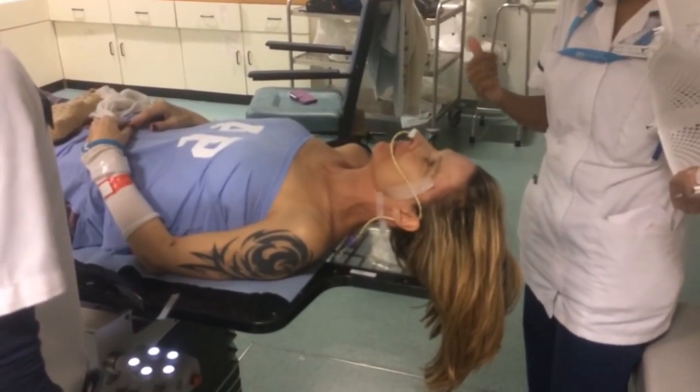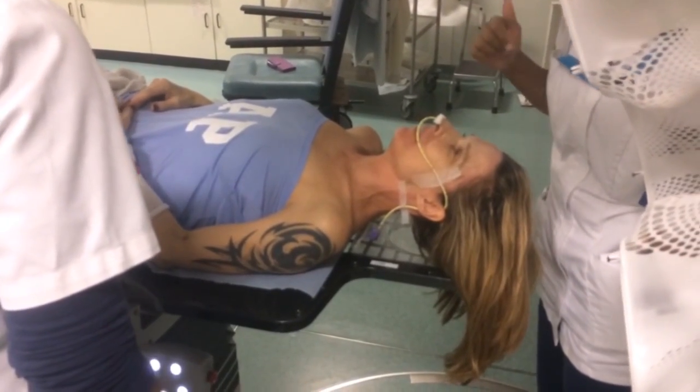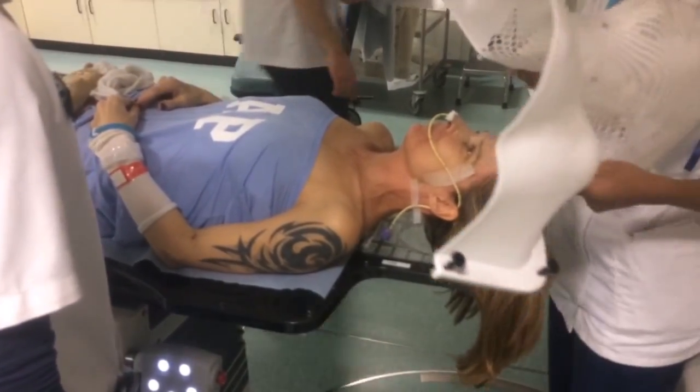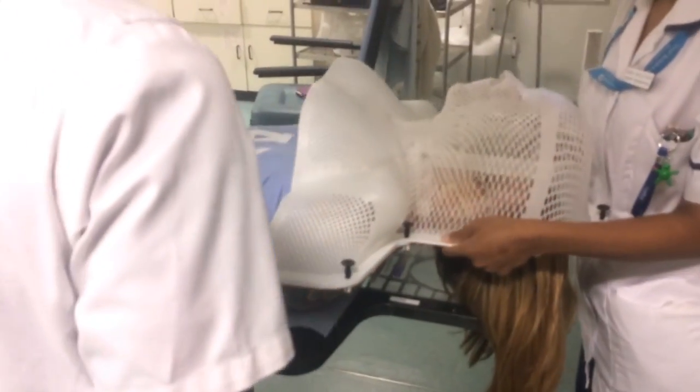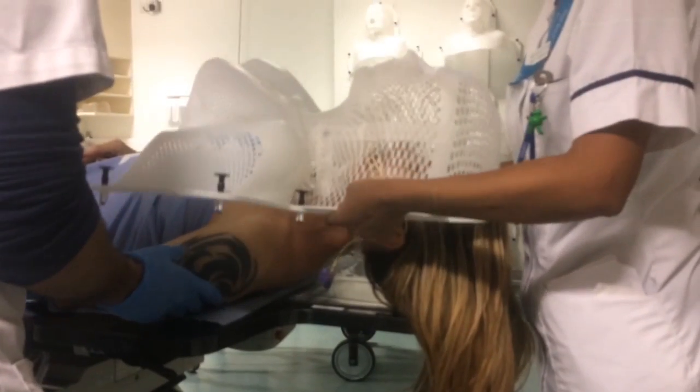So today, I think because your tube's now on the left, that little pokey bit is up there, we're going to have to get your head turning over to the right a little bit when I put the mask on, okay? So you tell me if it's uncomfortable anywhere. I'm going to stretch it up over your ears as much as I can.